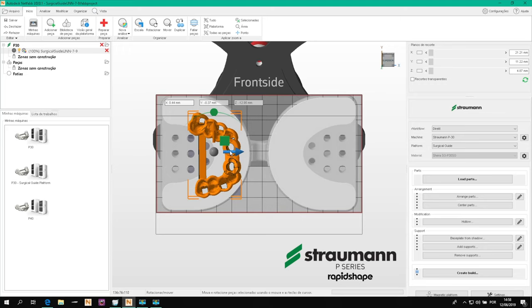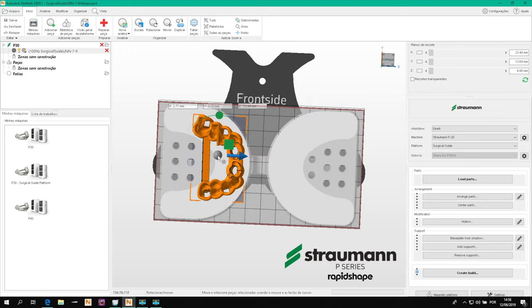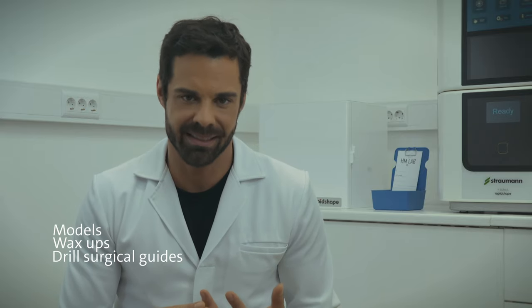Once we have the design of the surgical guide, we are ready to print. The digital file of the surgical guide will be transferred to the printer software, where we can visualize the real guide on the platform of the 3D printer virtually. This allows us to understand the true position and ensure the correct placement for optimal printing. We can also choose the material for printing. 3D printers are combined with multiple resin materials, allowing us to print several applications like models, wax-ups, drill surgical guides, provisional rehabilitations such as crowns, bridges and full arches.